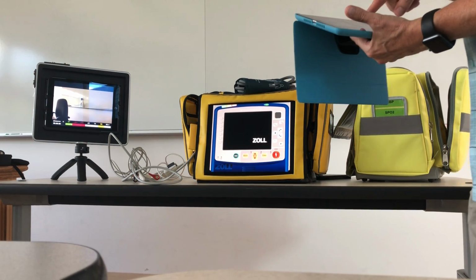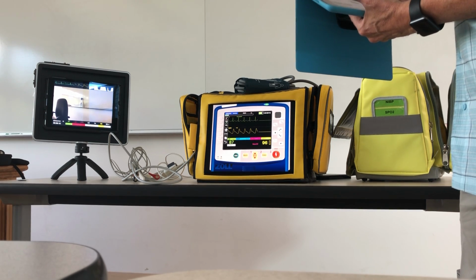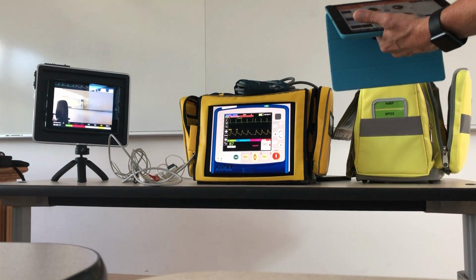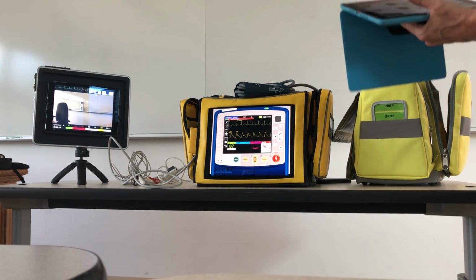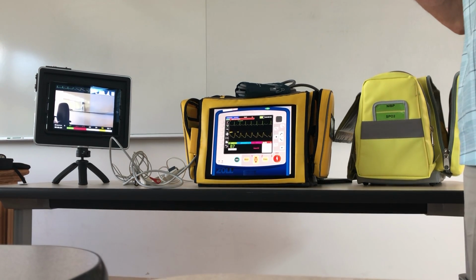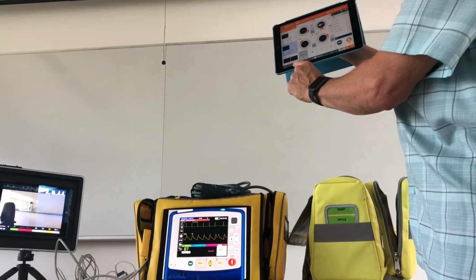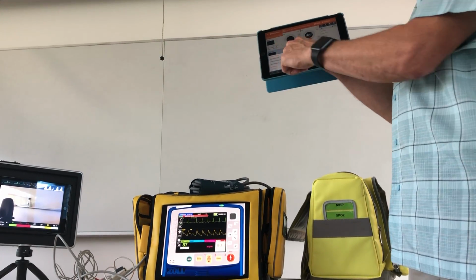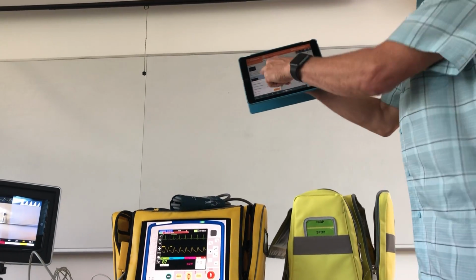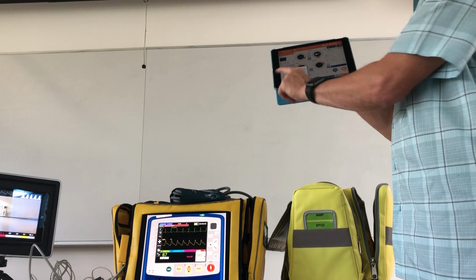As we're going through this scenario and we've added all of our features, we've got everything going, we can change patient parameters and do different things. One of the other pieces it has is a tool for the facilitator to flag. As you're going along, there's a little button at the bottom that says flag. They've created 3 categories: performance, communication, and teamwork. And there are 6 little toggles here: good or poor performance, good or poor communication, good or poor teamwork.